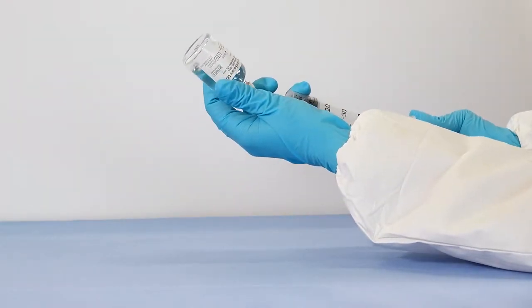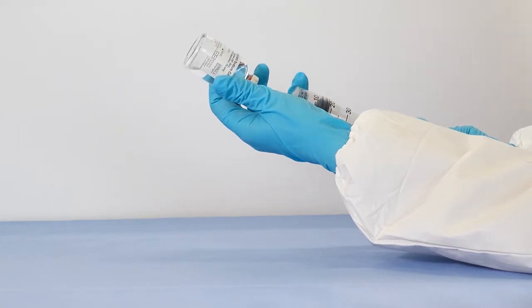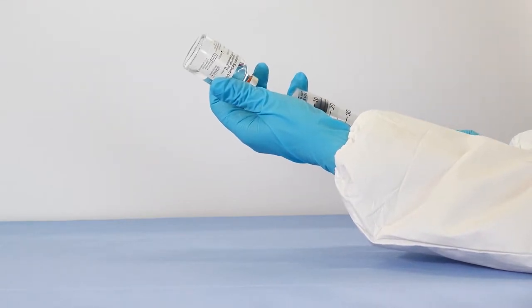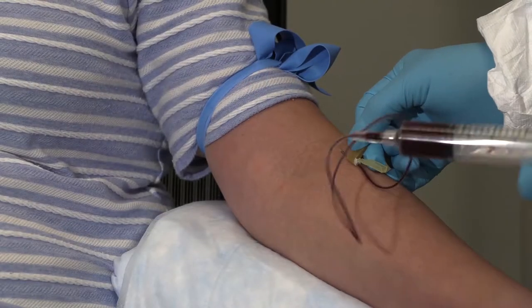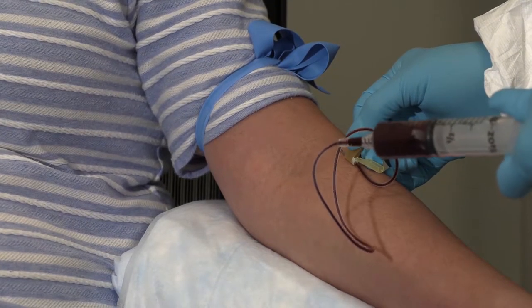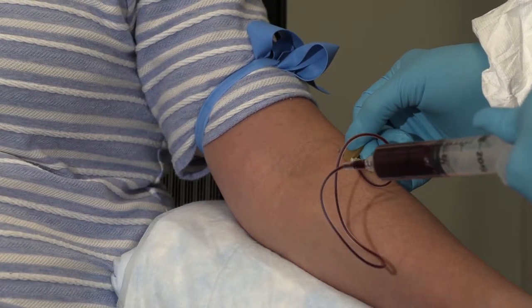Fill a 60-milliliter sterile syringe with 6 milliliters of citrate anticoagulant. Then draw 54 milliliters of blood from the patient, filling the syringe to 60 milliliters.